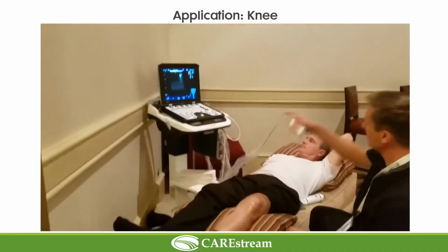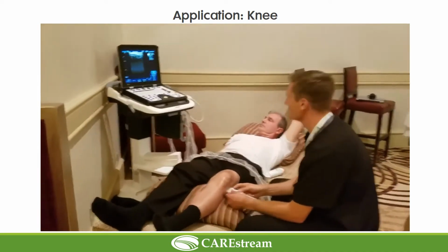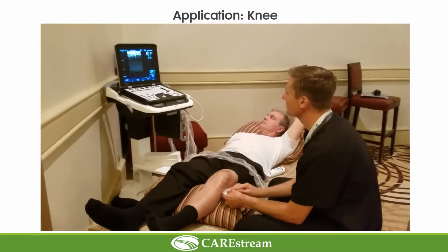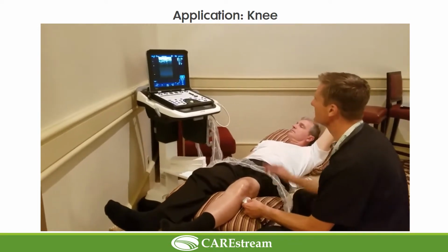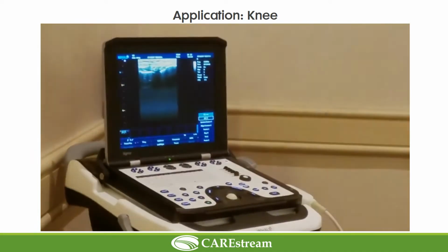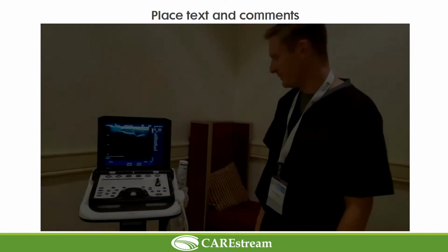The lateral meniscus, same thing. You're going to start on the midline and go down the leg, always just a little bit lower than most people think. Same thing in the same fashion, the ice cream cone in the middle of the two bones. That is your lateral. And now let's label our image.